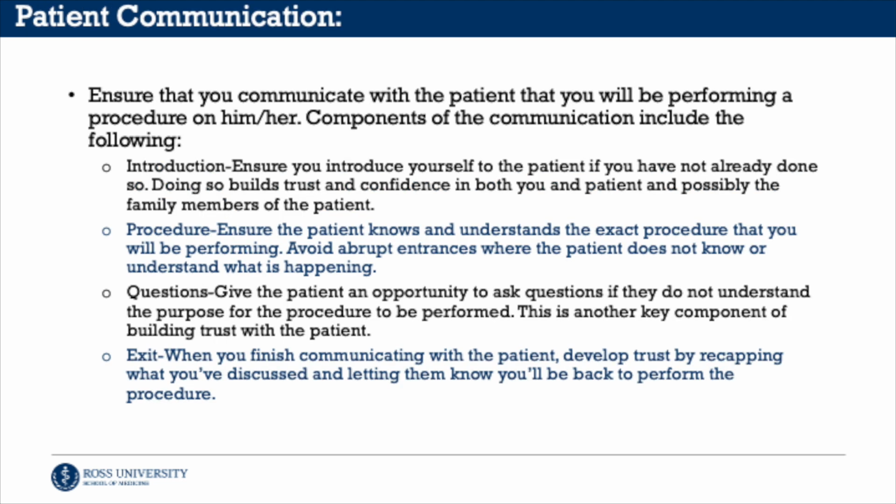Patient communication is incredibly important, not just in this procedure, but in all procedures. Ensure that you communicate with the patient that you'll be performing a procedure on them. Components of the communication include the following: an introduction, what the procedure entails, giving the opportunity for the patient to ask any questions, and then as you finish, make sure that you recap so that the patient has a complete understanding of the procedure and everything that you've discussed.